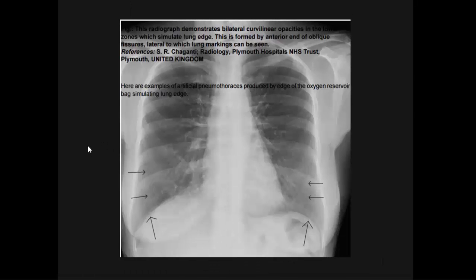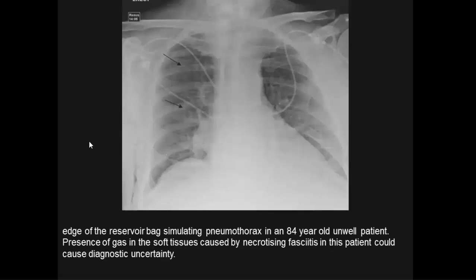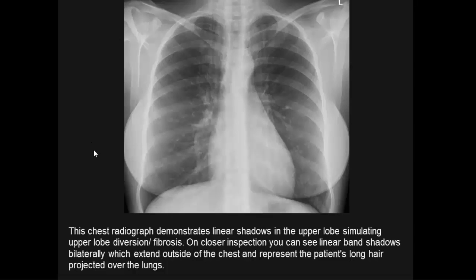Further examples: bilateral curvilinear opacities in the lower lung zones simulate lung edges formed by anterior end of oblique fissures. Closer inspection reveals lung markings lateral to the apparent lung edge, caused by an oxygen reservoir bag. The edge of the reservoir bag simulates a pneumothorax in an 84-year-old patient. A linear shadow in the upper lobe on plain radiograph simulates upper lobe diversion and fibrotic process.